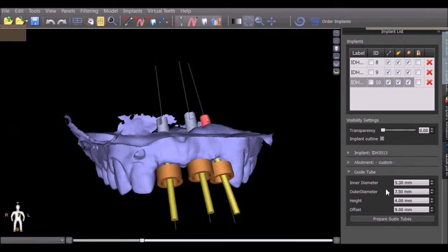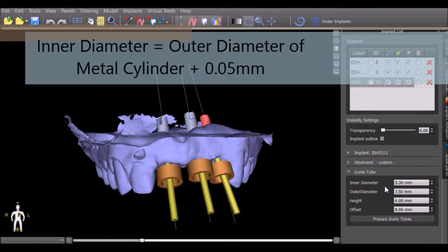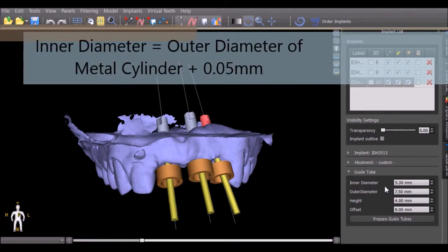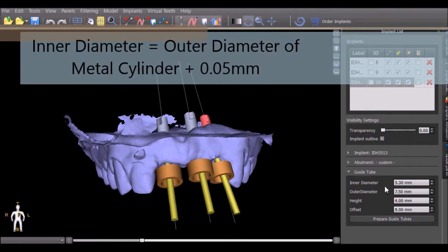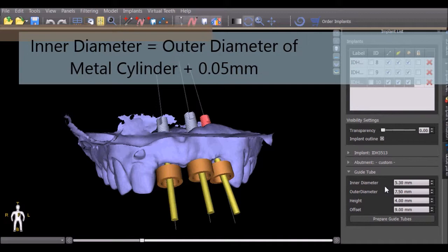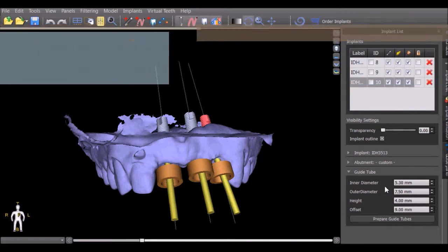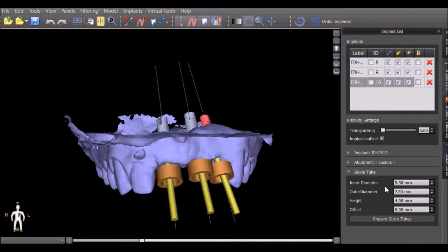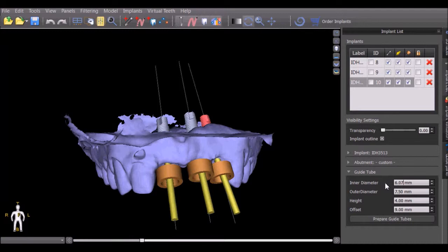The inner diameter of the guide tube should be set to be 0.05 mm larger than the outer diameter of the metal cylinder which will be inserted into the guide. For example, if the outer diameter of the metal cylinder is 6.02 mm, then the inner diameter of the guide tube should be set to be 6.07 mm.